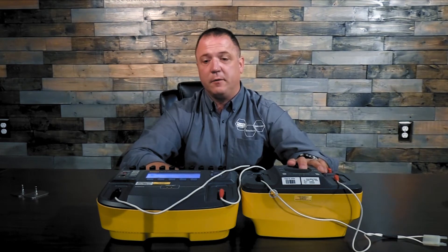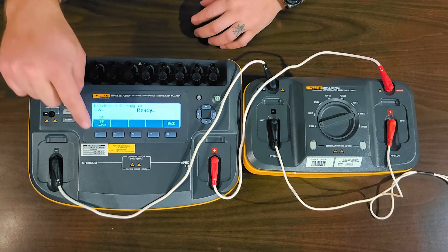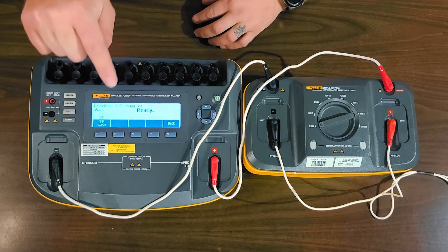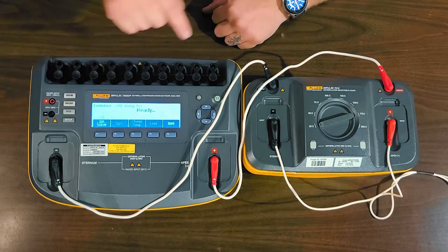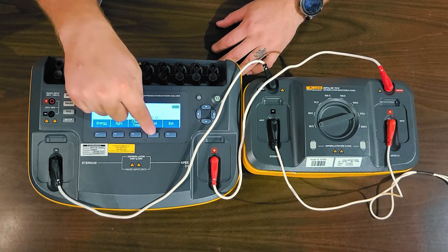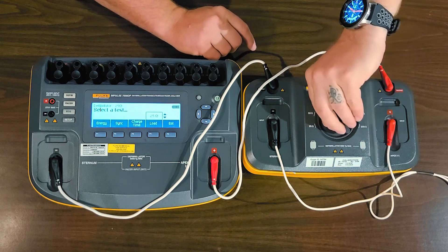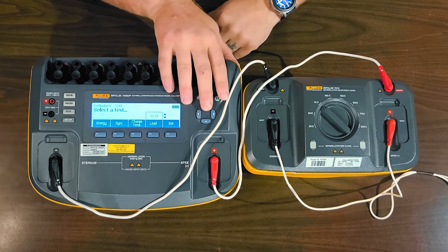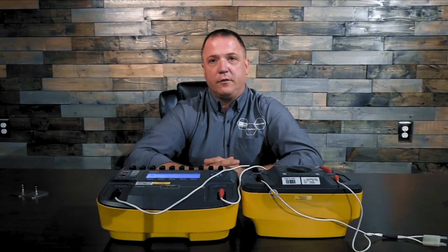Typically the next one would be 25 Ohms. Simple enough — we're going to set our 7010 loadbox at 25 Ohms, then go back on the Impulse 7000 to load and set 25 Ohms. Make sure the two are corresponding, and now we do our discharge test at 25 Ohms. Once completed, go back to load — we already did 50, so we'd probably go to 75 next. Please reference that service manual. Set 75 Ohms here and do the discharge tests.